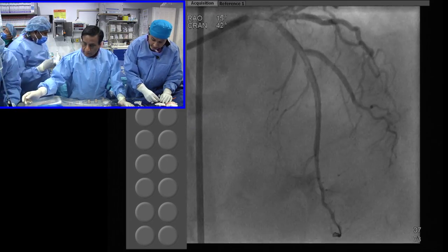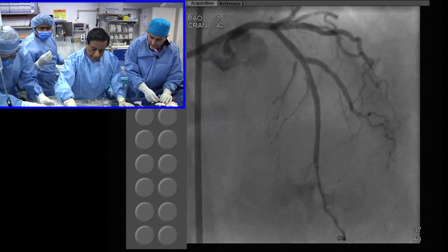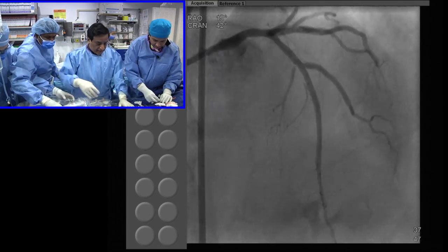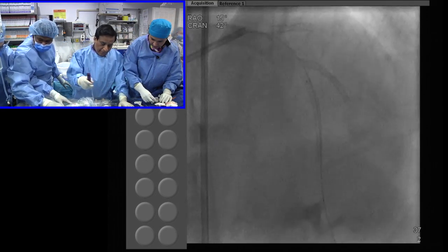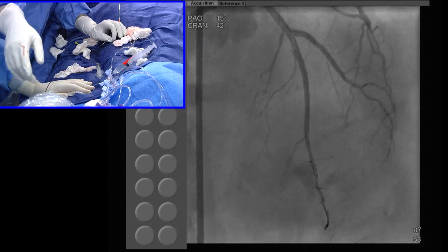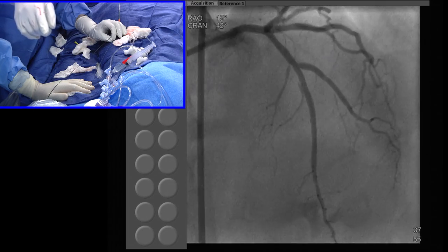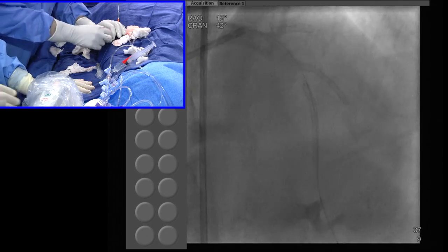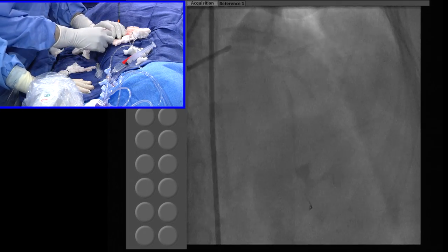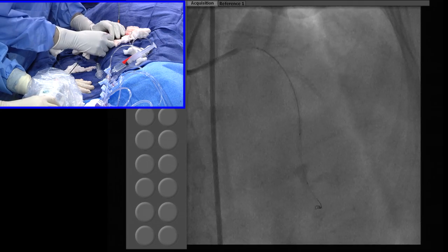Yes. Basically, the data by Ormiston say that you can increase by 0.8. Actually, it was not the pressure which made the difference; it was the size. So you can go up to 0.5. That's the recommendation. Don't go 1. Because 0.8 is okay. Get closer, guys. Pay attention. So that is why the whole issue of the 0.5 comes in. Good.